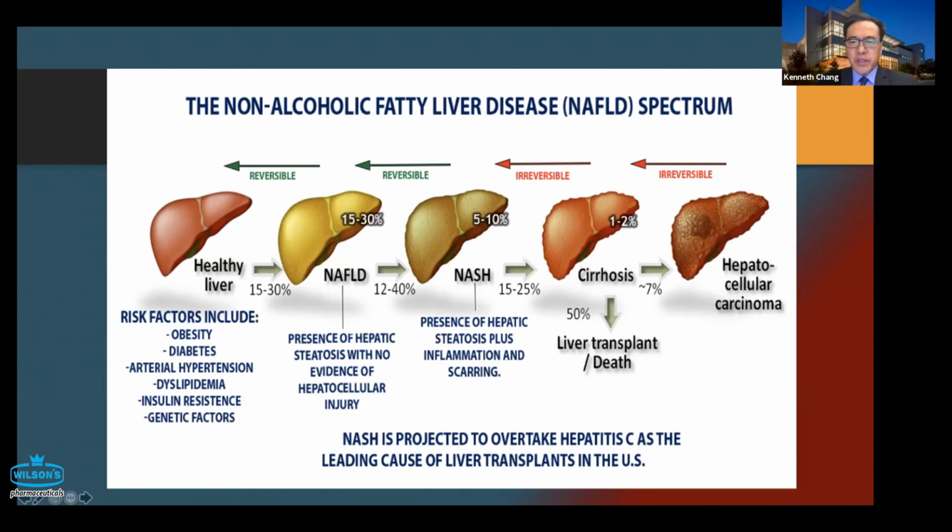So with the portal pressure measurement, I think that's where this unmet need is addressed, because we can now diagnose patients even pre-cirrhotic. Patients can have mildly elevated portal pressure down in the 6 to 10 range, and at that time the platelet count is normal, the INR is normal, the bilirubin is normal, imaging is normal, but the patient is already progressing towards METAVIR stage 3 and 4 without clinical understanding of that. So portal pressures can be very helpful.